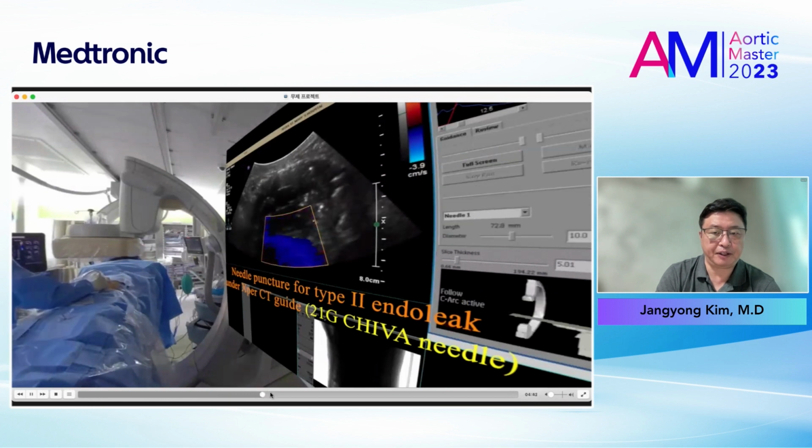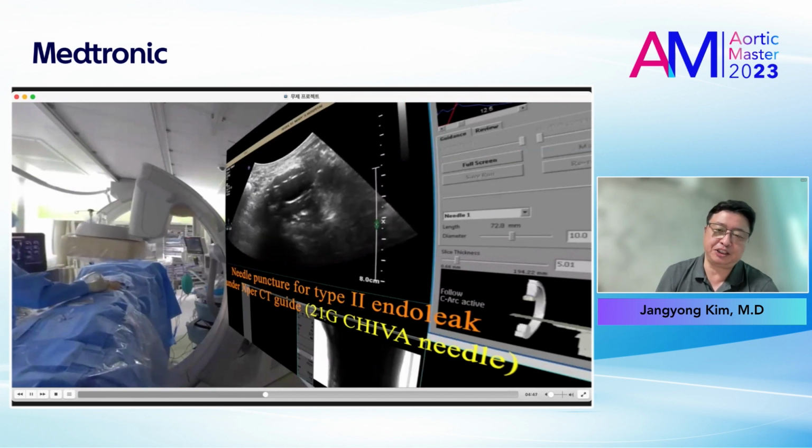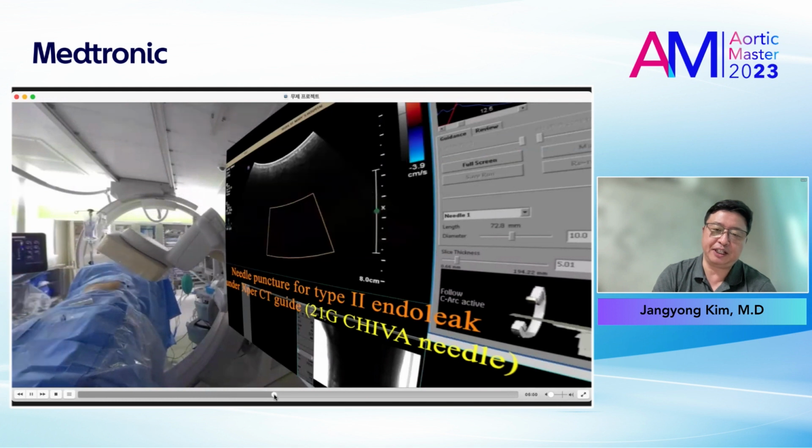Even though he did multiple punctures to localize the lesion, it was not easy with ultrasound localization.